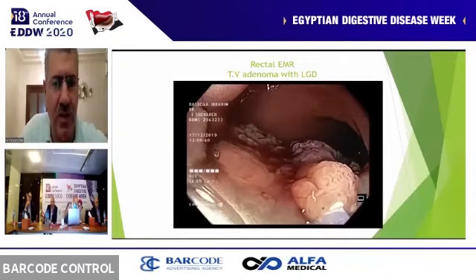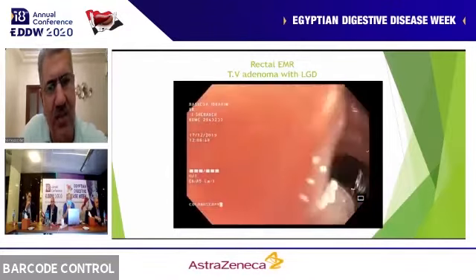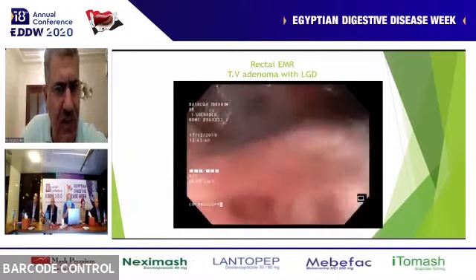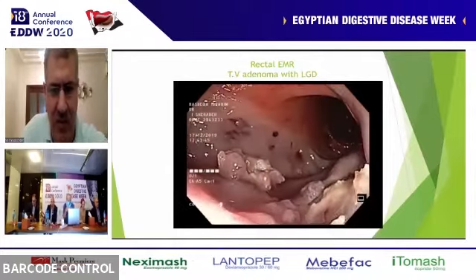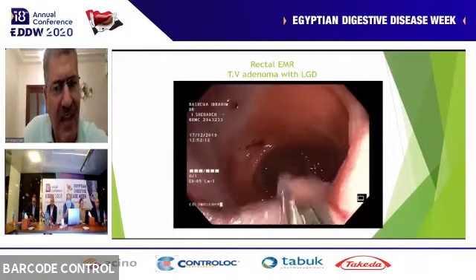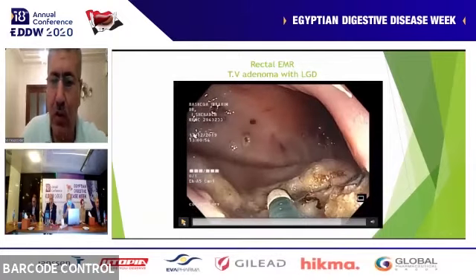now it's a policy of mine. When you evaluate the polyp, if you by any chance evaluate one part of the polyp to be more dangerous than the other part, that's the polyp you need to make sure that you remove in one piece with all the adjacent tissue so that you can evaluate that pathologically correctly. In this lesion, you can see the whole lesion looked actually okay. There were no more dangerous places. I removed it in piecemeal, but then the edges, or any adenomatous tissue that you think is present, needs to be removed, either with a regular forceps or with a hot forceps if you have that.